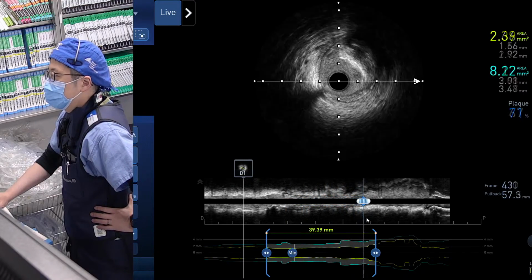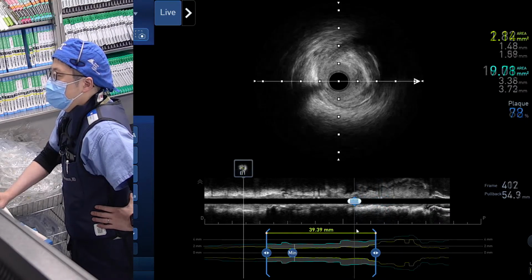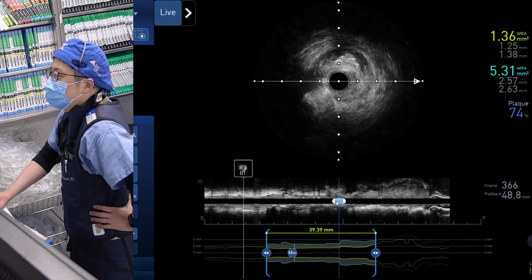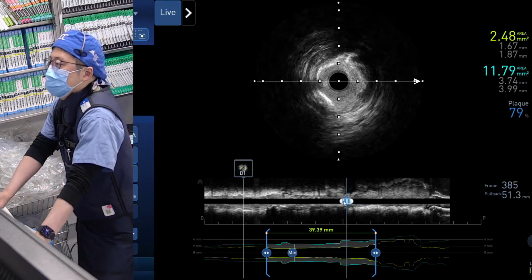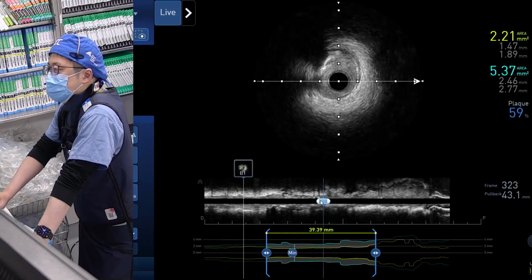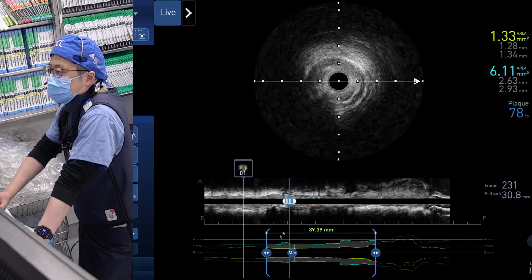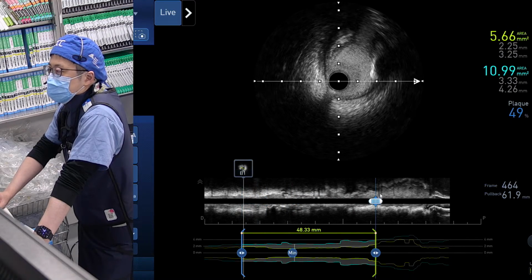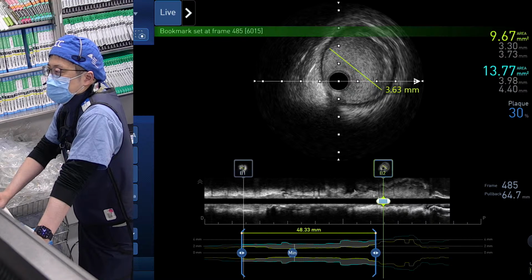2.5, 48. There was an area with significant calcification. It was focal, less than 90, more than 90. The previous angiogram looked like more calcium, but today I could not say. Maybe the view is not clear. There were a few areas of 180-degree calcification.